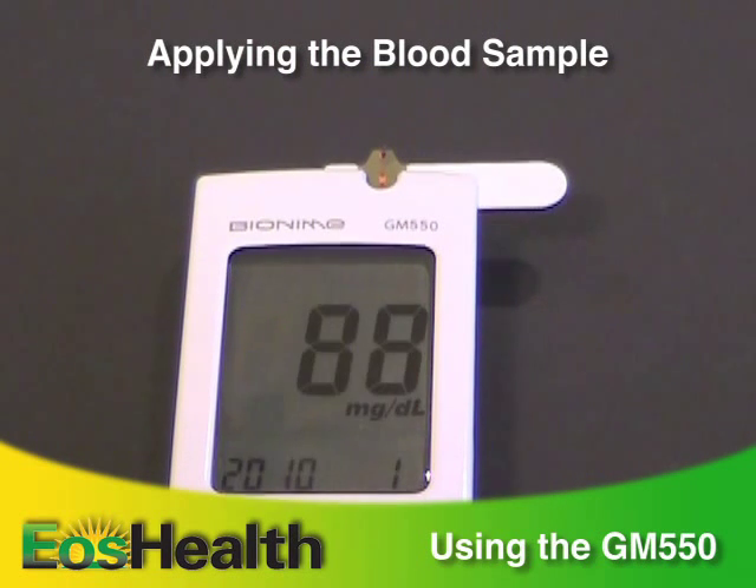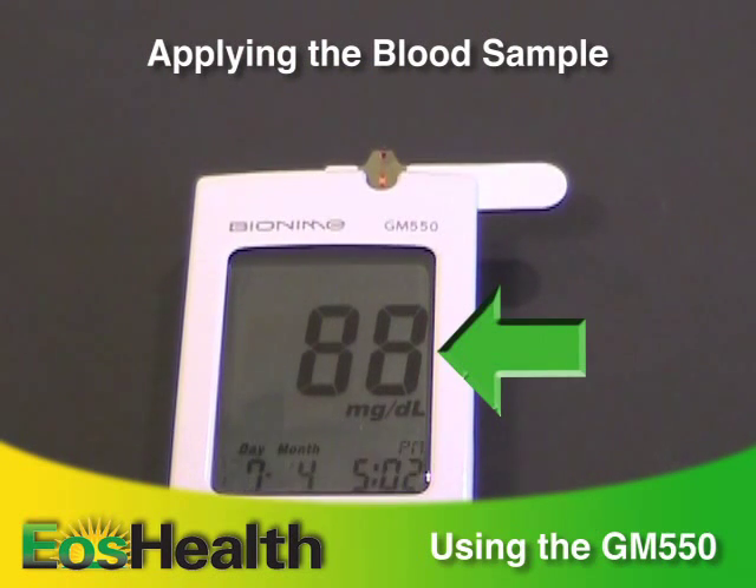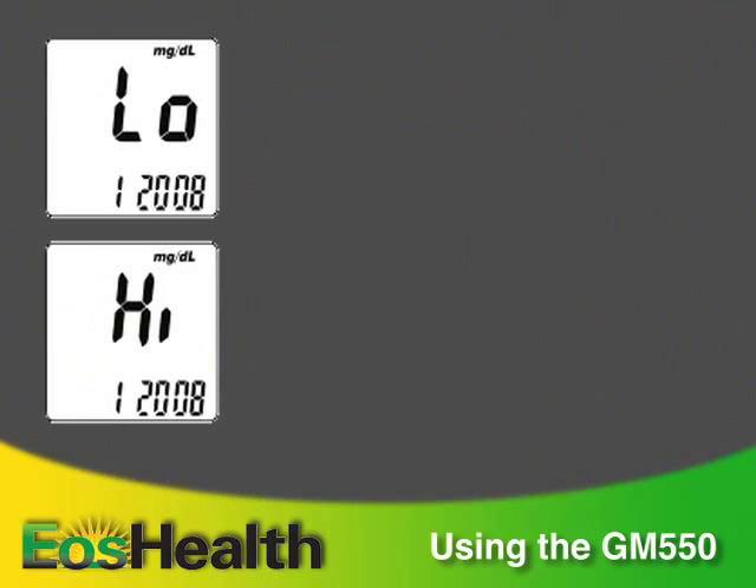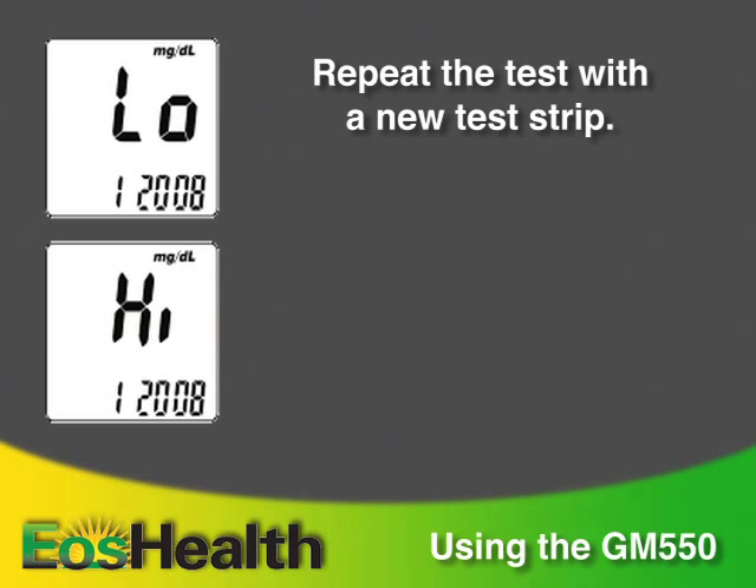After about 5 seconds, the test result appears on the screen with the date and time below it. If you see the letters LO for low or HI for high, repeat the test with a new strip.